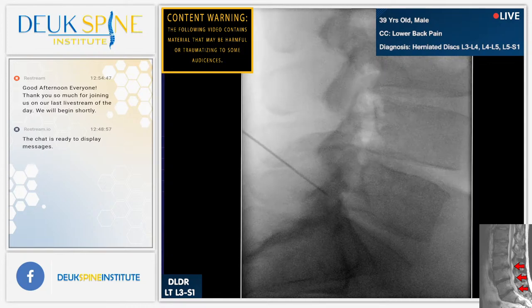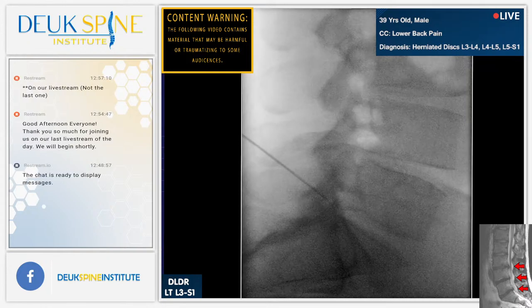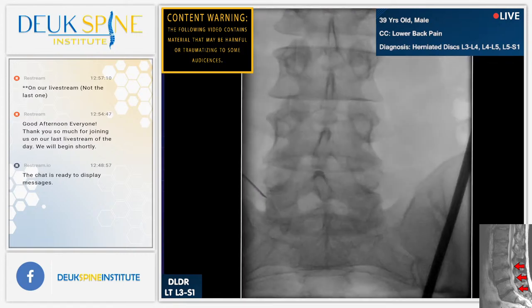All right, so it's looking pretty good in terms of the trajectory. The first disc I'm aiming for is L5-S1, and I'm just slipping around the facet joint. I want to wait till he's a little more awake. Let's get an AP. And just do some numbing on the skin. And then we're going to make our incision shortly. And looks like he's responding a little bit. Shot, perfect, that looks good.